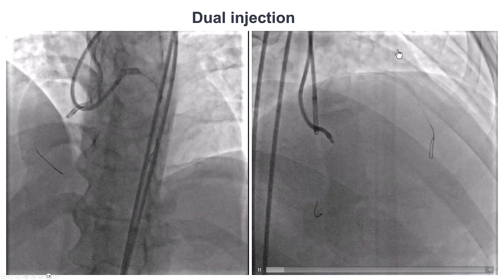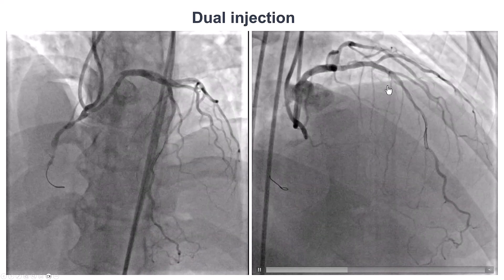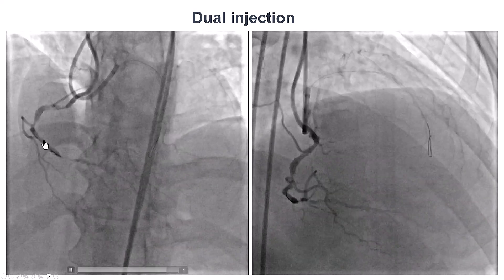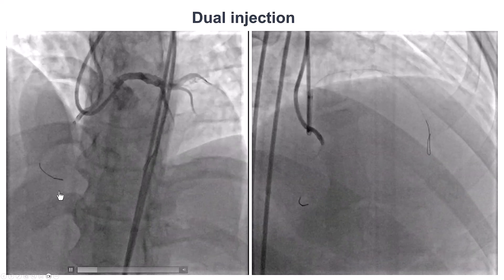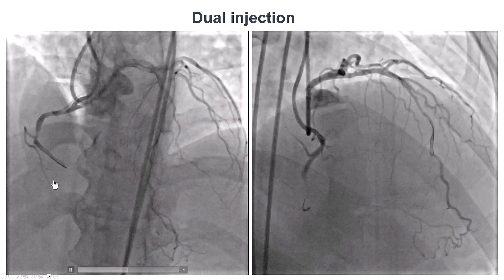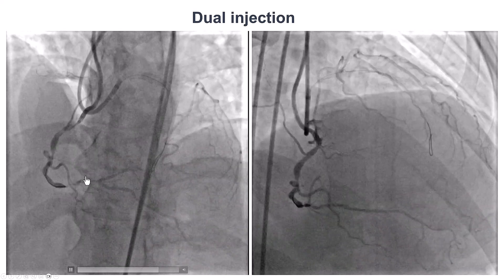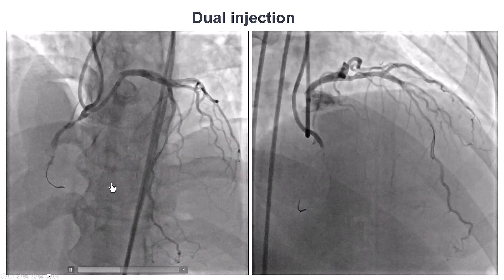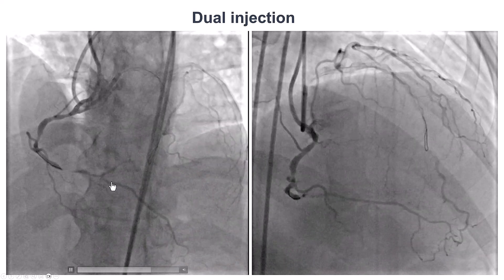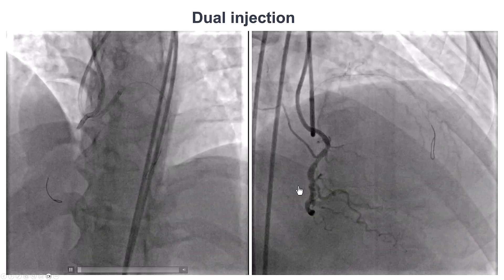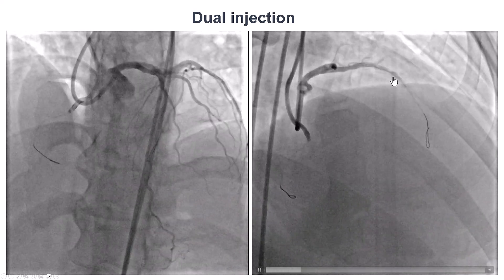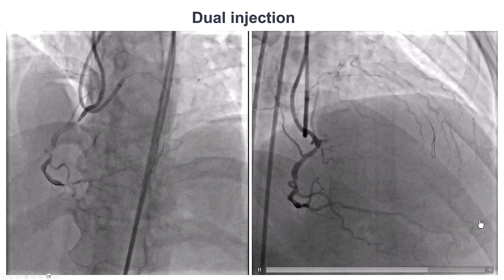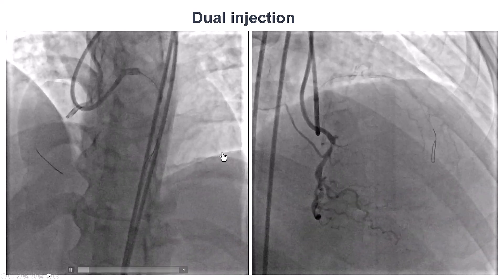This is a dual injection. We see that the previously placed stent in the LAD is well expanded. There is a CTO of the distal right coronary artery that is fairly short. There may actually be a microchannel in the lesion, and the distal vessel has some diffuse disease. The distal cap is proximal to the bifurcation of the PDA and the PLV. There are some septal collaterals that could be used for retrograde crossing, as well as some epicardial collaterals.